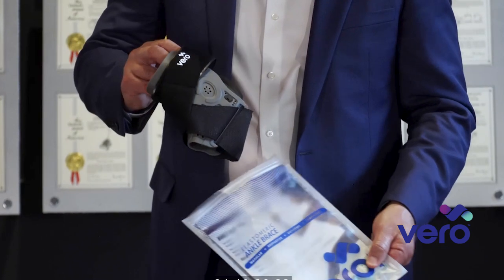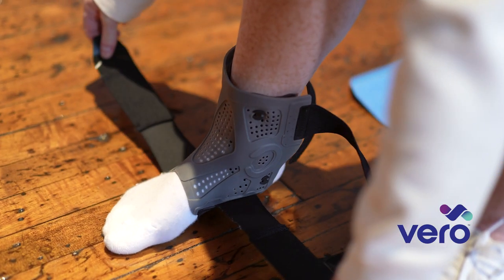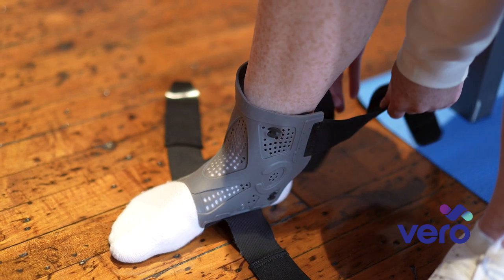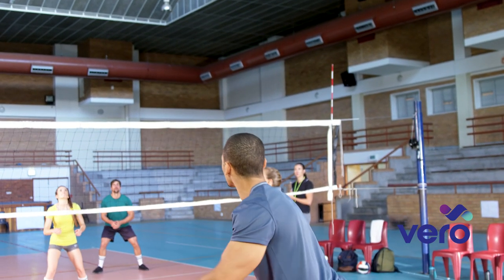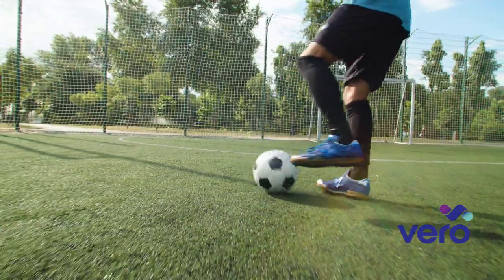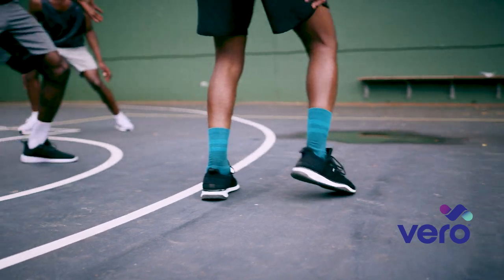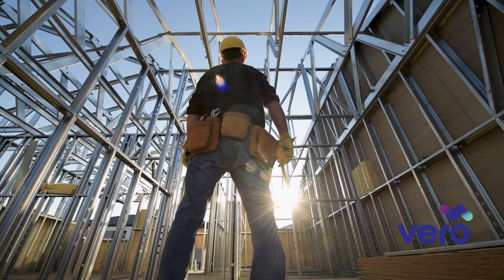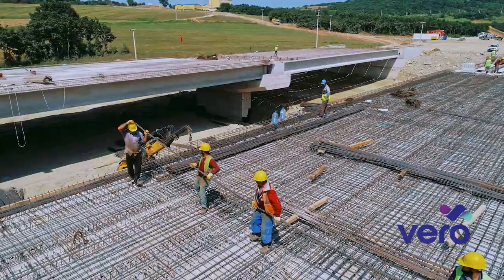The Vero Ankle Brace was designed for comfort, ease of use, enhanced rehabilitation, and injury prevention. We really focused on two types of athletic activity: sports like volleyball, soccer, tennis, pickleball, and basketball, and what we call industrial athletes — construction workers, painters, drywallers, iron workers, etc. Anyone with an ankle injury or looking to prevent one will benefit from the features of the Vero Ankle Brace.